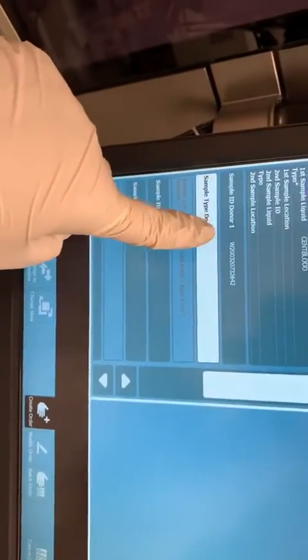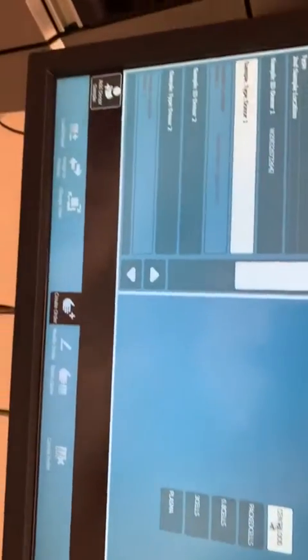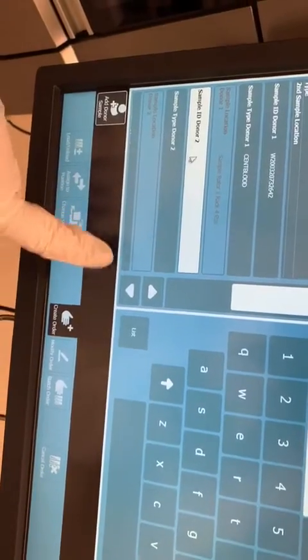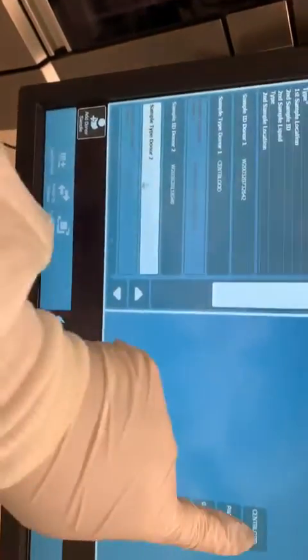I'm going to click here, and you have to go back over on the left and select Centrifuge Blood. It's really Pax cells, but Pax cells doesn't work — you don't have to ask why. You have to say Centrifuge Blood. Same thing with donor number two: Centrifuge Blood.